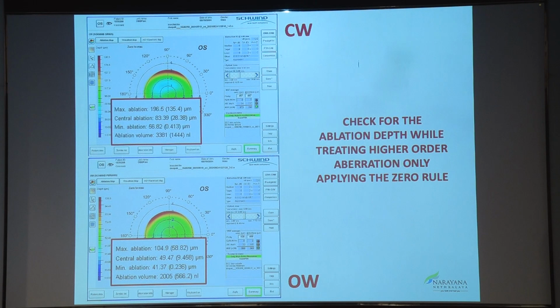It takes into account your corneal thickness, ACD, axial length, and it takes close to 20 parameters. And once you feed in your refraction, it takes a few seconds to get ready because it's calculating. It's like making its own plan for that axial length, and it will tell you this is what you need to correct. So the entire adjusting, everything is gone.